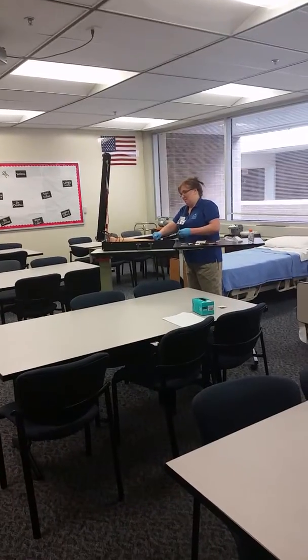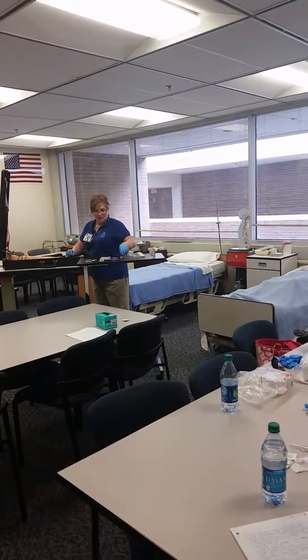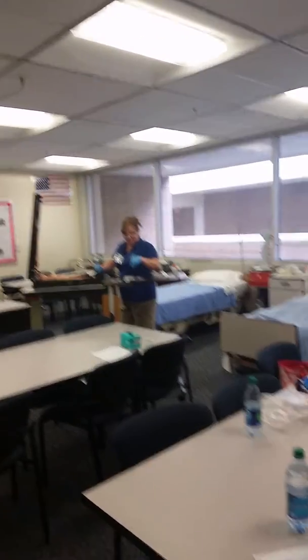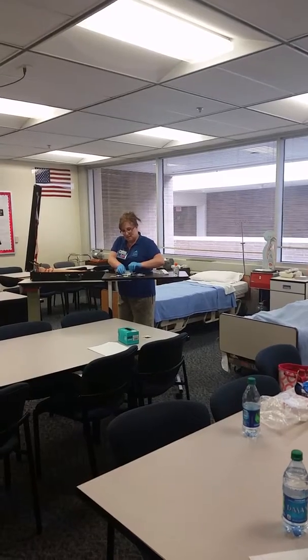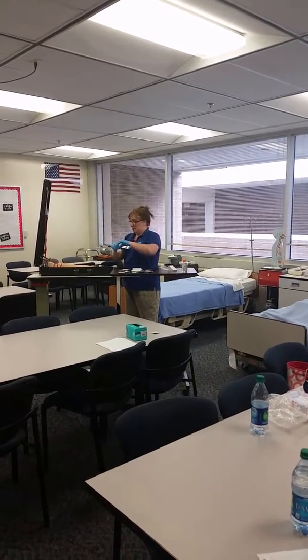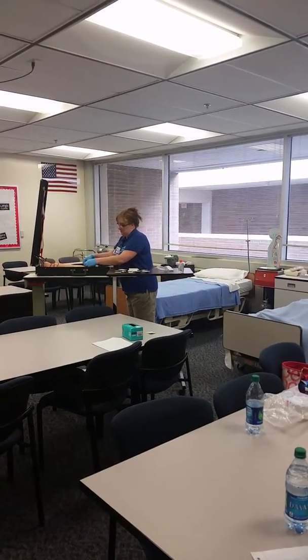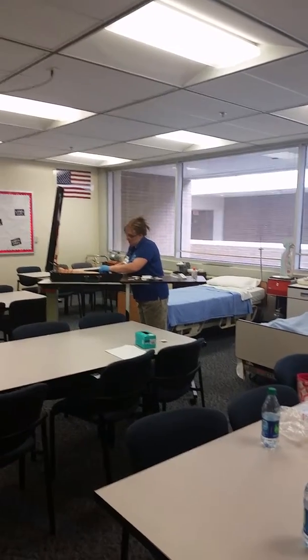Okay. I'm going to remove this. I will place my needle in the sharps container. And I'm going to apply the Tegaderm, placing it over the catheter, making sure not to cover it where it interferes with the IV.